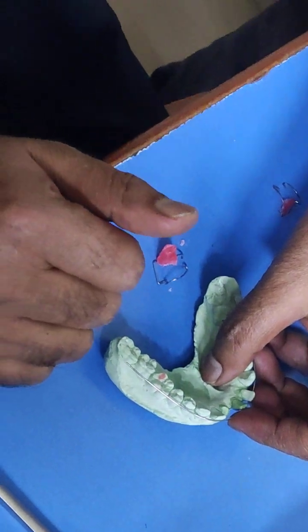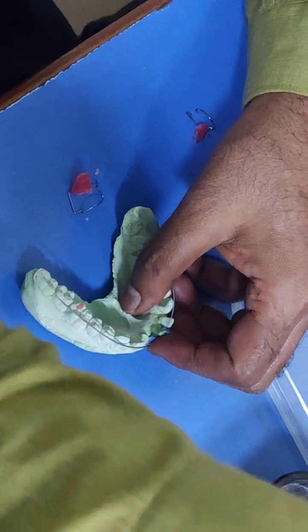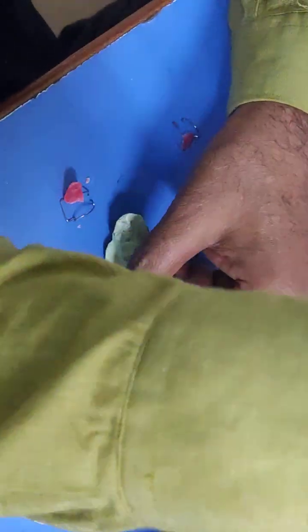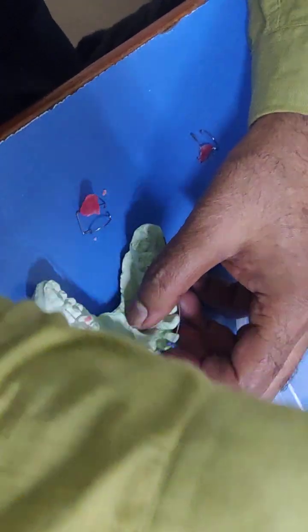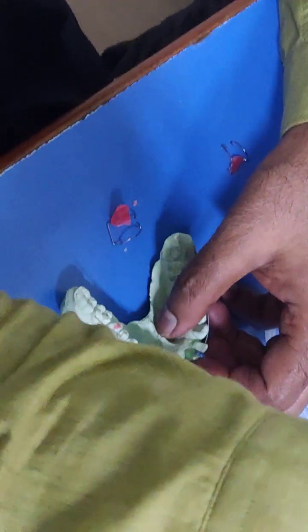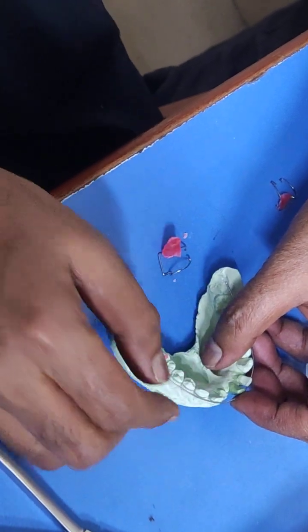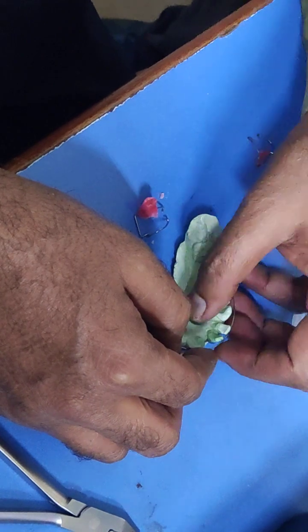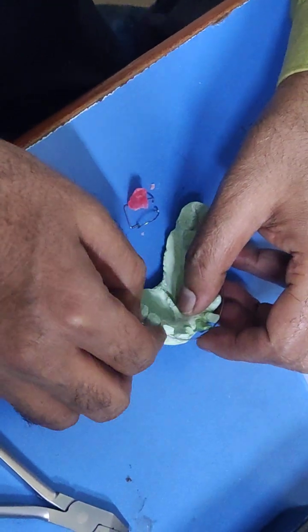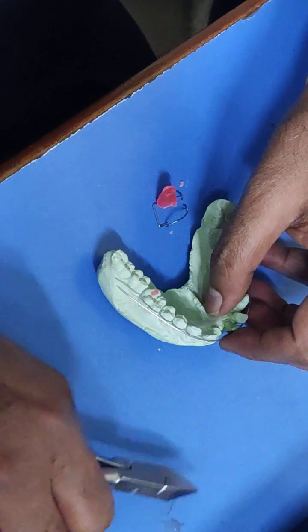It's quite wide spacing. So remember, for 1 millimeter retraction, 2 millimeter space is required. This is the thumb rule. So if there is 8 millimeter space, that means 4 millimeter retraction will happen. So we will make the U-loop relatively wider because sufficient space is available there.